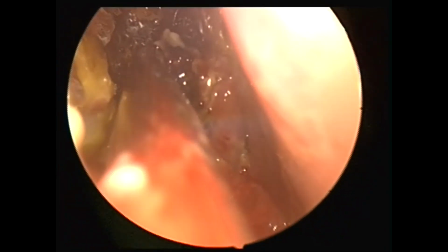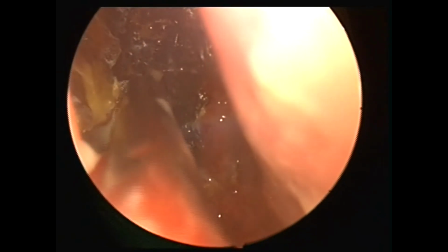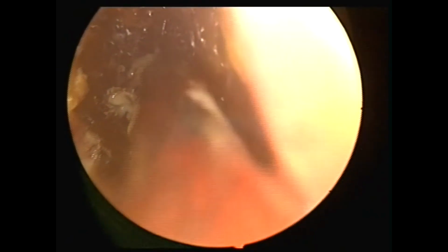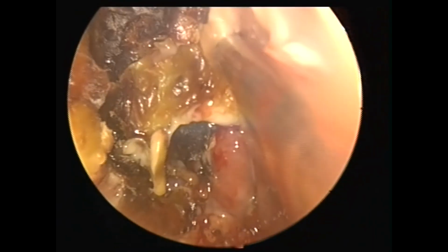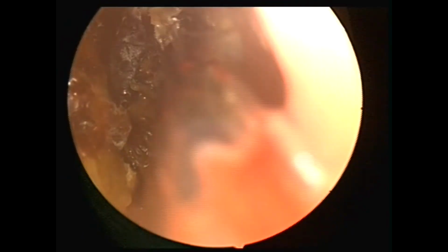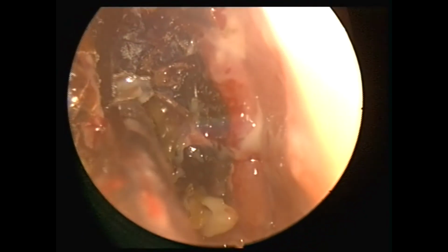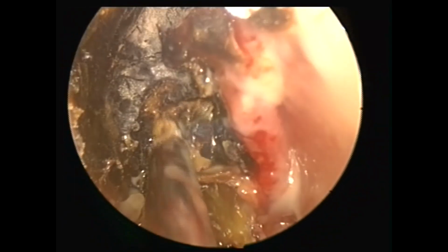What I'm going to do is take away all that scab slowly, making sure I do not injure any mucosa and form any raw surface again. So just gently with the suction, I'm going to try to elevate that off the mucosal surface. As you can see, it's coming off in pieces, and a very small raw surface is being formed again because of the separation of the scab.